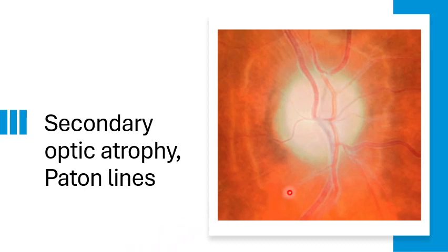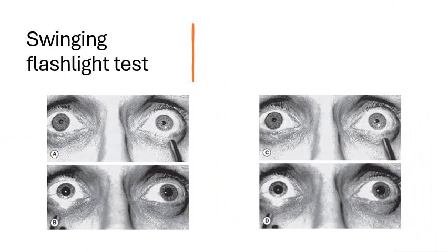This is a secondary optic atrophy, so the patient had either optic neuritis or papilledema and passed untreated to end up with this secondary optic atrophy. Again, there is loss of the normal salmon pink color of the disc, there is loss of the optic disc cup, there is ill-defined retinal margin, and there is sheathing of the blood vessels. They are sheathed, so we can find like a transparent sheath around the retinal blood vessels. Those are the signs of secondary optic atrophy.